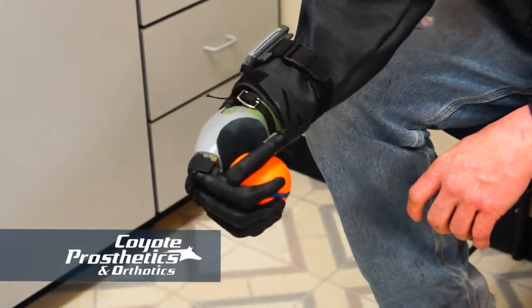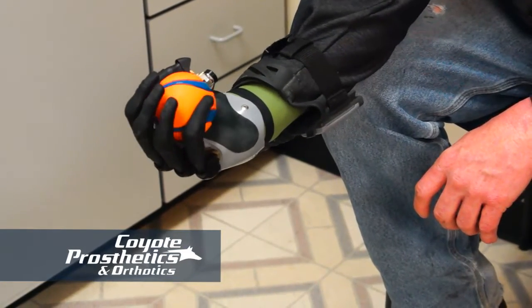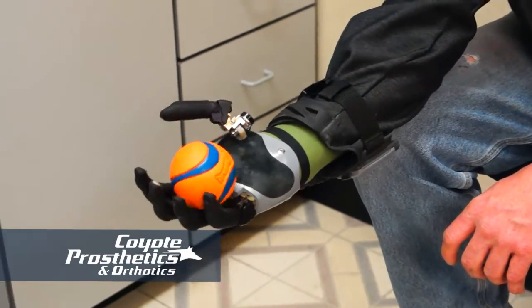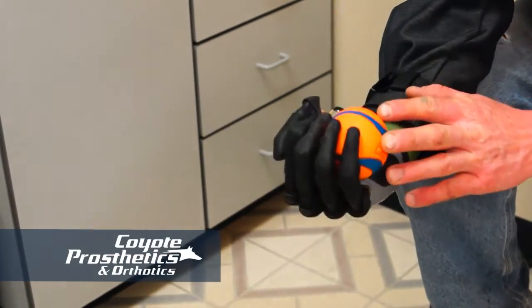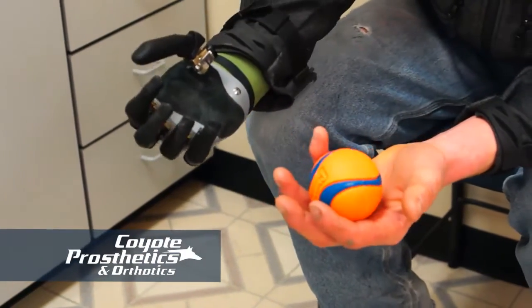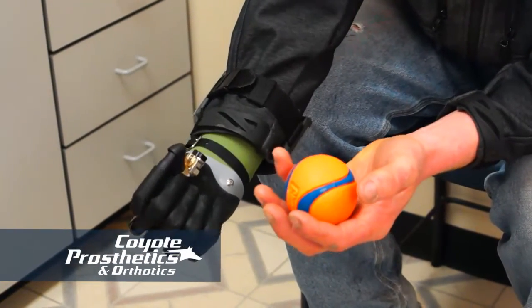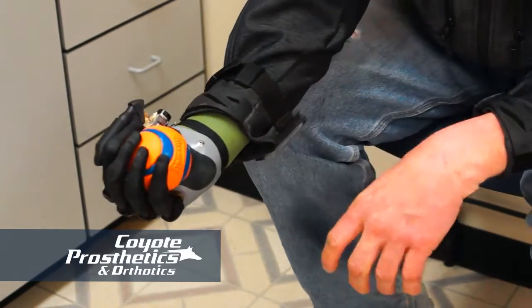I'm still learning what it's going to help me do. I could catch a ball with it, as long as it wasn't like a line drive or a fast pitch. I could probably toss a ball. I don't think I could — I wouldn't be able to pitch a ball or throw it a long distance with it. It would hold a kitchen knife.